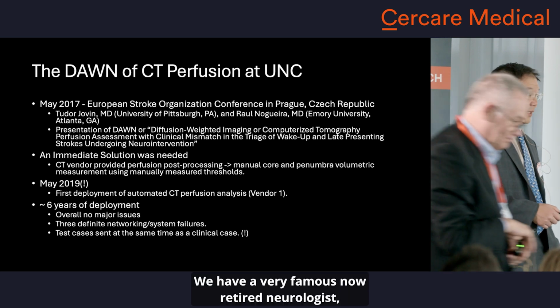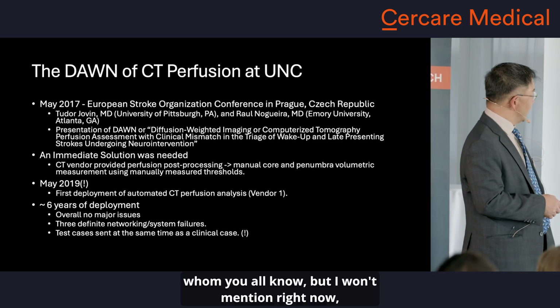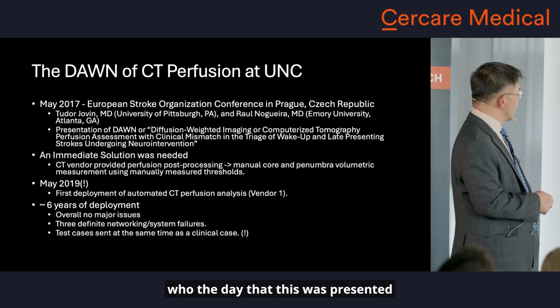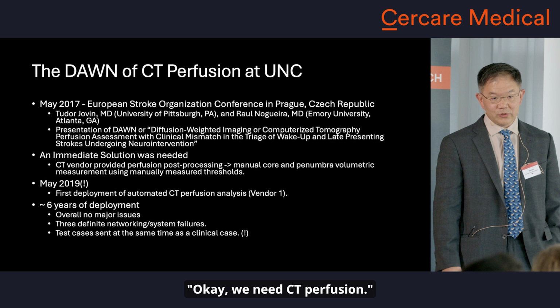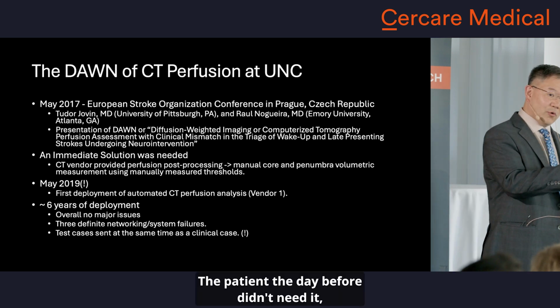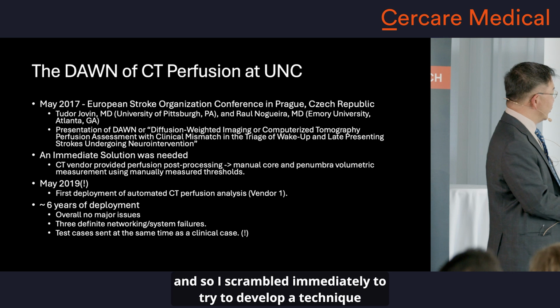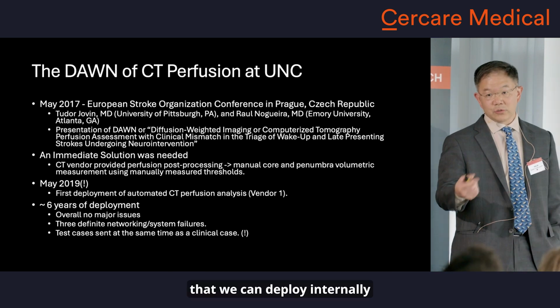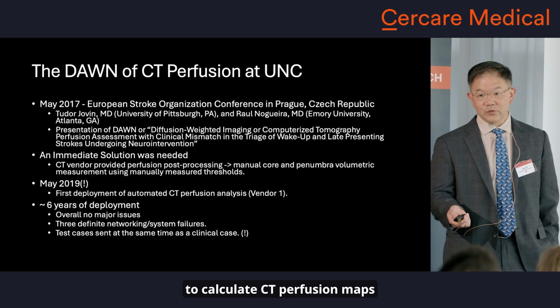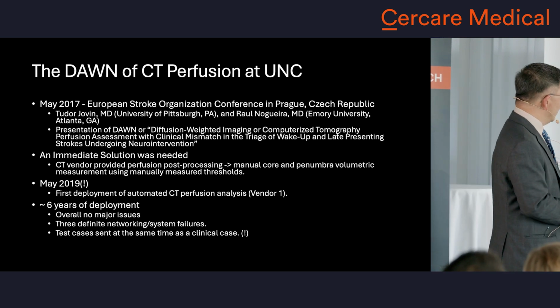So our experience at UNC with CT perfusion for stroke is actually a little bit unique. We have a very famous, now retired neurologist, whom you all know, but I won't mention right now, who the day that this was presented at the European Stroke Organization calls me and says, okay, we need CT perfusion. The patient the day before didn't need it, but the patient the day after did. And so I scrambled immediately to try to develop a technique that we could deploy internally to calculate CT perfusion maps so that we could have core and penumbra.